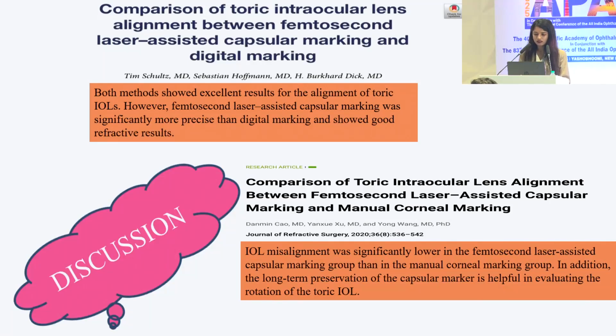Tim Schultz compared the toric intraocular lens alignment between femtolaser assisted capsular marking and digital marking, and concluded that both methods showed excellent results for toric IOL alignment. However, femtolaser assisted capsular marking was significantly more precise than digital marking and showed good refractive results.